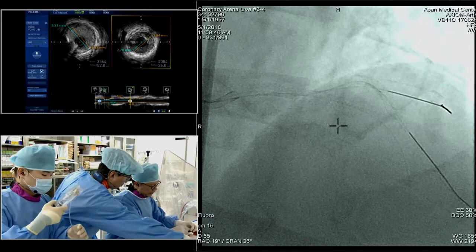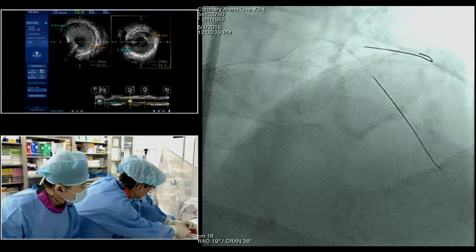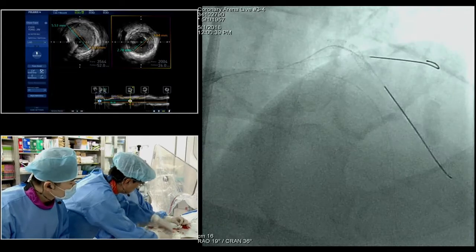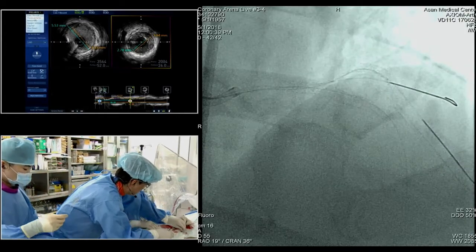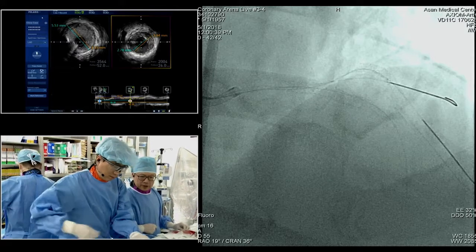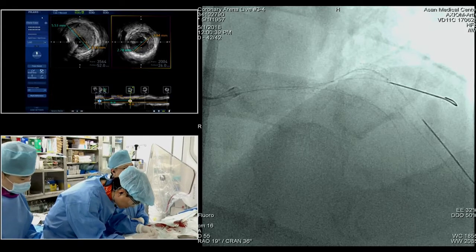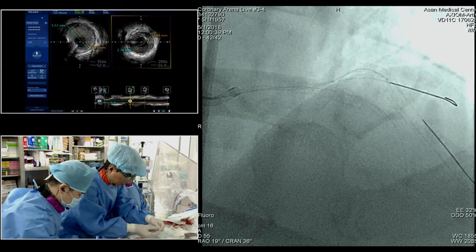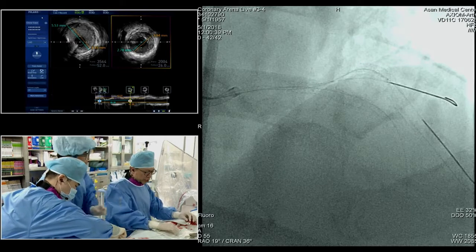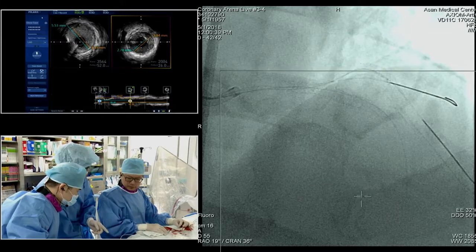I know that many of us will probably do a little pre-dilatation, but I think here it is probably okay to do that, and not much calcium. If there's any calcium, I would pre-dilate so that we can have a good expansion of the stent subsequently. So maybe a little nitro? Nitro, yeah. So we're going to go back and take a caudal view of angiogram and see before we do an IVUS in there, see what it looks like. The caudal view probably shows the worst. Just a moment, just nitro, okay.